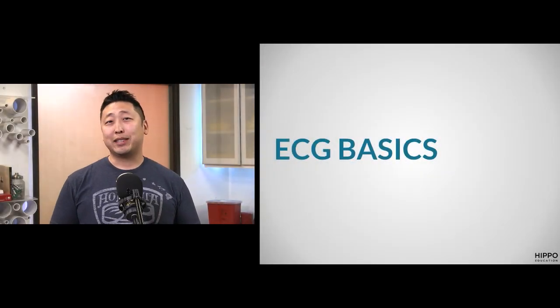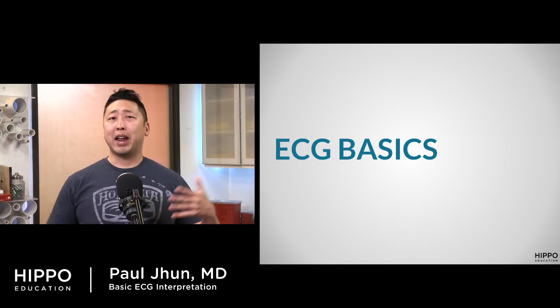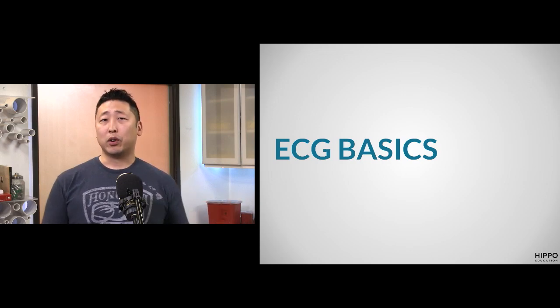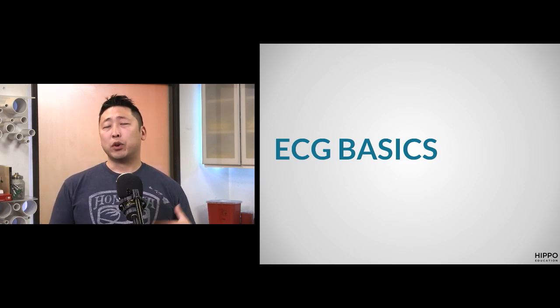Let's talk about ECG basics. Now, this is an ultra fast refresher talking about general rules of thumb about how to interpret the foundational things about ECG interpretation, leading up to the advanced section that you're going to be going to next. Now, there's an understanding that you have some experience with interpreting ECGs, but let's actually go about it.